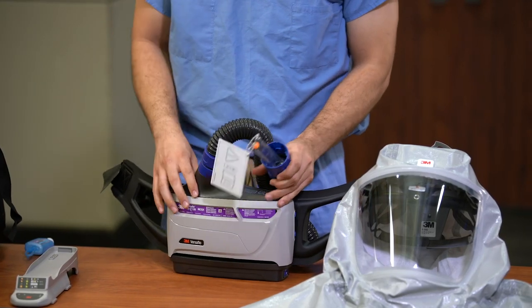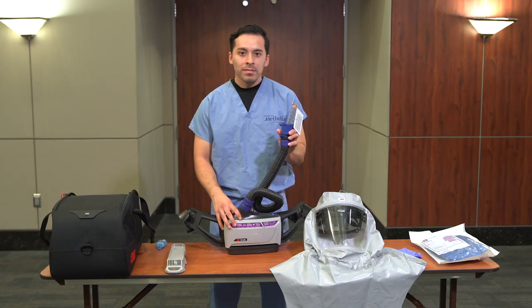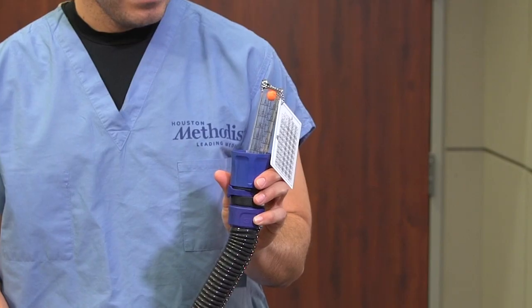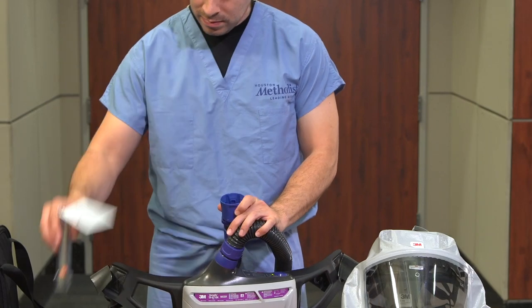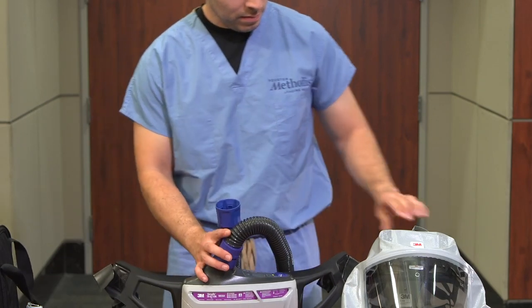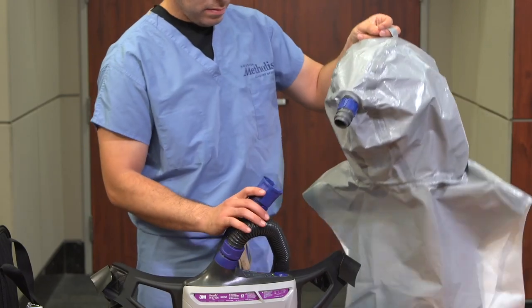Ensure that the orange ball floats at or above the F mark in the meter to confirm that the hose is not damaged or obstructed. Remove the flow meter from the hose and retrieve the head cover from the bag. Attach the hose to the head cover to make ready for donning.